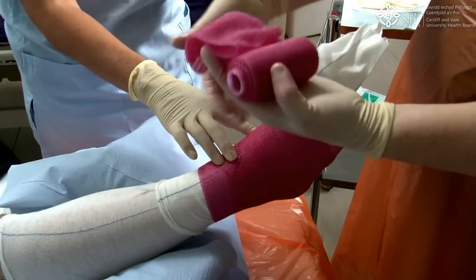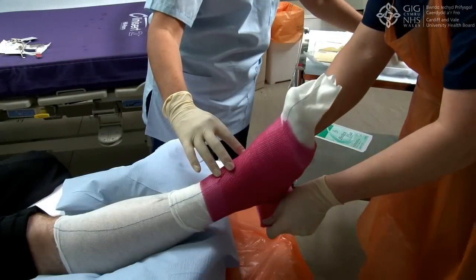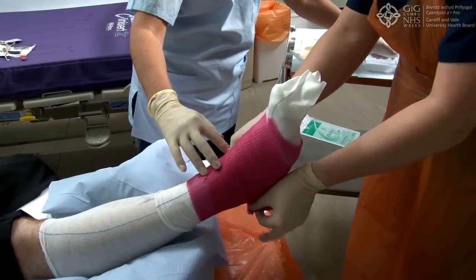Fold over the semi-rigid casting tape 3 or 4 times and cut. Apply to the area that requires pressure relief.